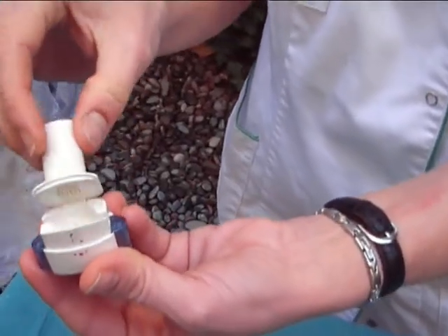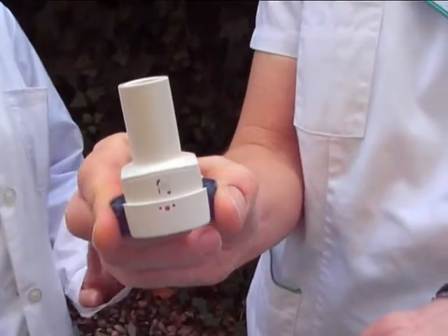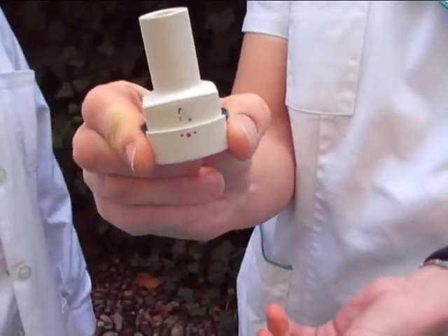Close the mouthpiece firmly. Press the two buttons simultaneously while keeping the inhaler upright. You will hear a click.